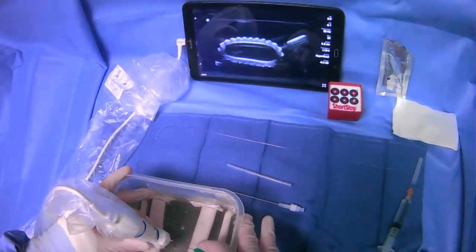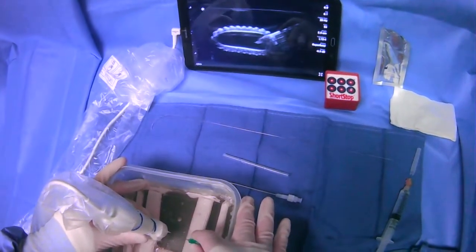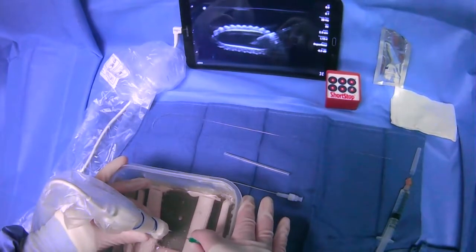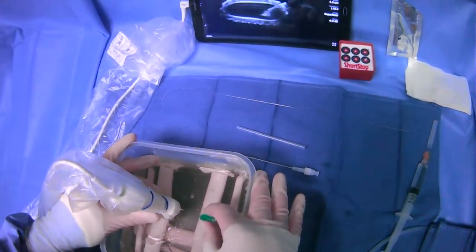We're going to get right outside, and then we're just going to puncture, making sure that we can follow the tip. We follow the tip — it's right in the lumen. At this point, we'd be getting blood back.